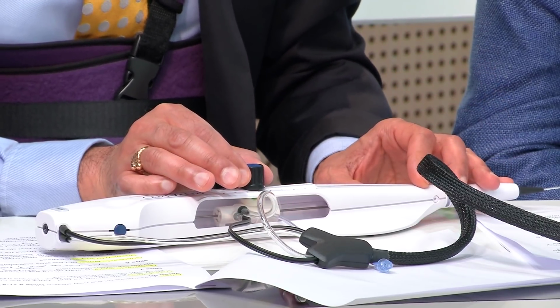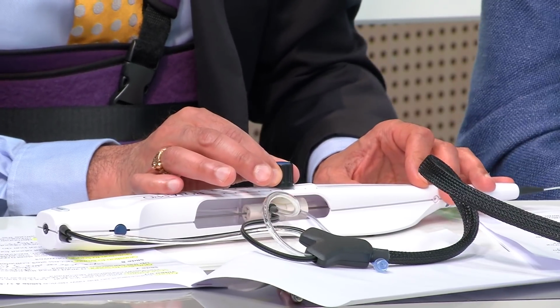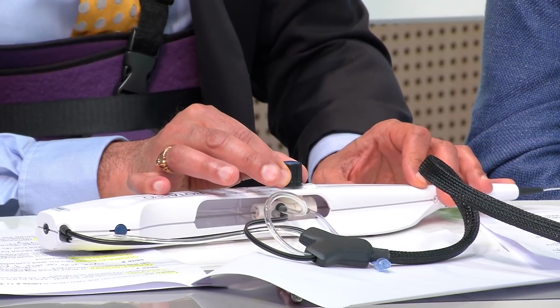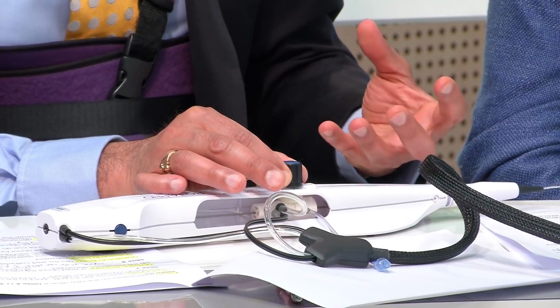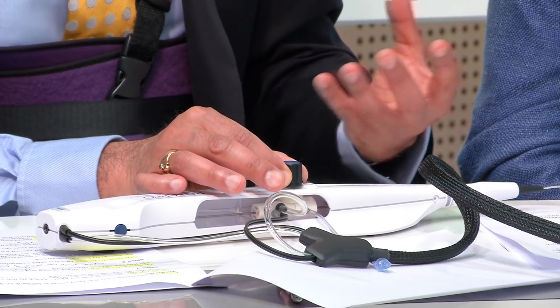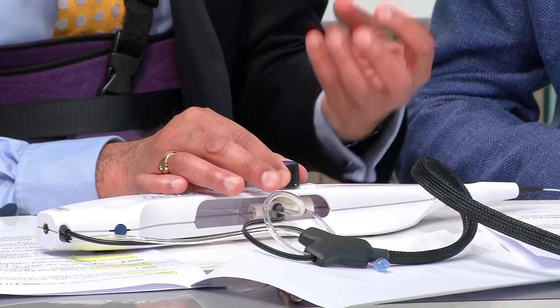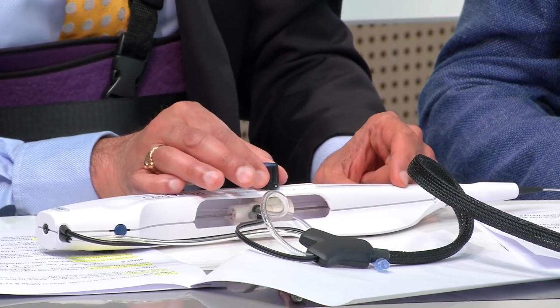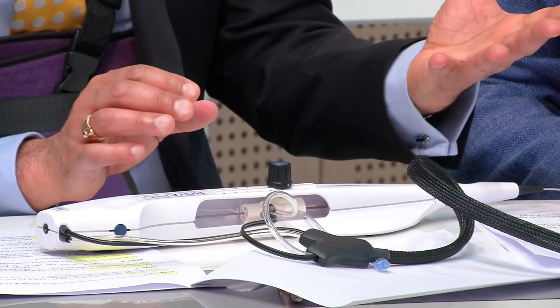What is not recommended is a fast dottering motion, which we have seen some operators use, and also sustained long forward pressure will just generate heat, will generate larger particulate debris, potentially increases the risk of slow flow and peri-procedural infarction, and really will run you into trouble, because if you push too hard, you also increase the risk of the burr jamming. So it's a gentle forward pecking motion, keeping an eye on the revs and keeping an eye on time.